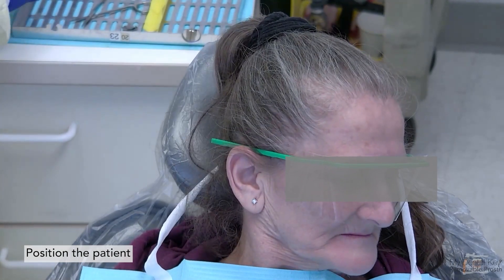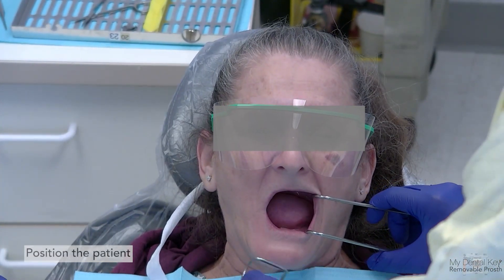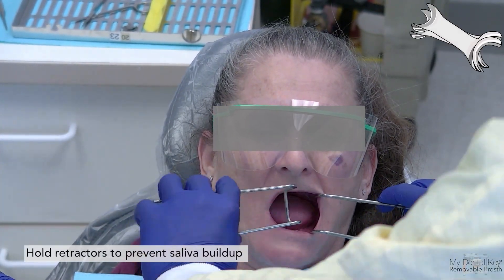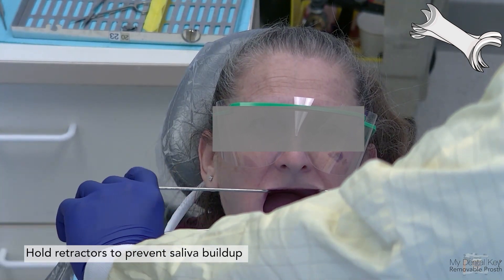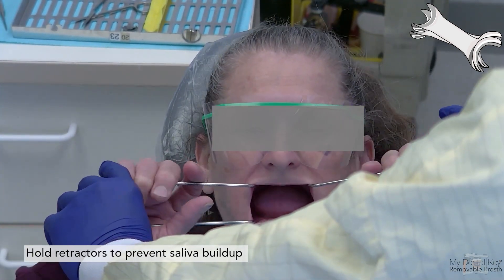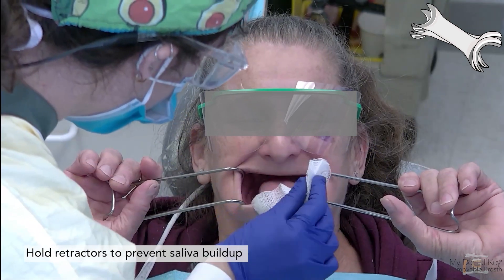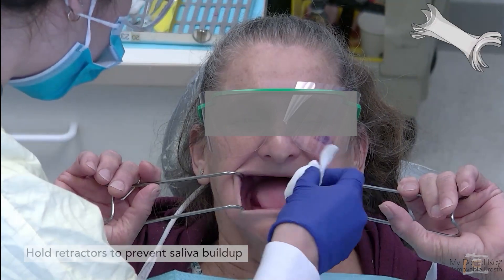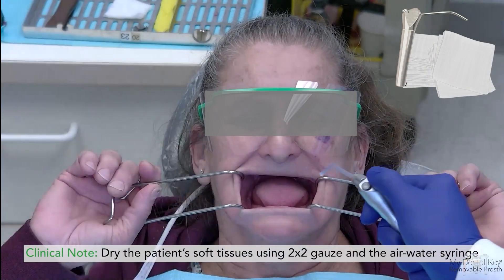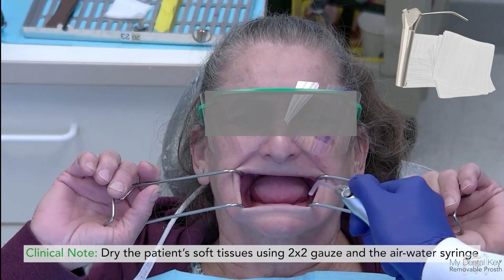Tip the patient's chair back so that you can easily place the tray in the patient's mouth. To aid placement and to ensure the patient keeps their mouth open and tissue stays dry, place metal retractors in the patient's mouth on either side — the patient or your assistant can hold those retractors. Dry the soft tissue with the air-water syringe or a 2x2 gauze.